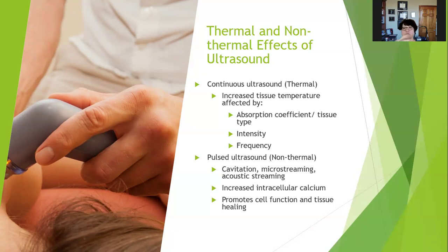Pulsed ultrasound, which is the non-thermal version, has effects that come about through cavitation, microstreaming, and acoustic streaming. We'll talk about what those are, and increased intracellular calcium. So non-thermal ultrasound promotes cell function and tissue healing. That's something you can't feel.